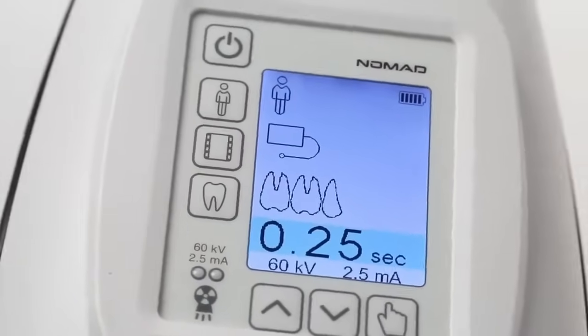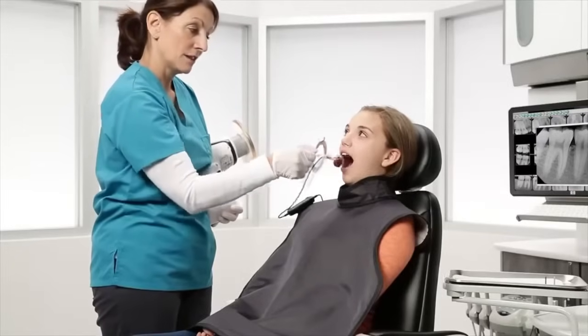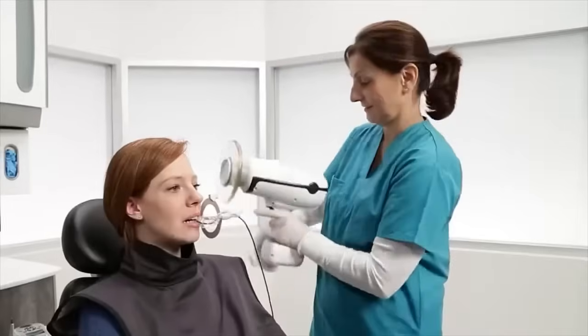From changing image capture settings to exposing the x-ray, you can be there by your patient's side, creating a positive experience for both you and the patient.